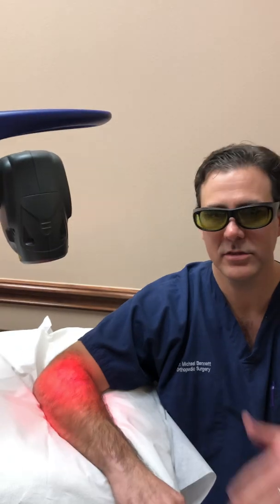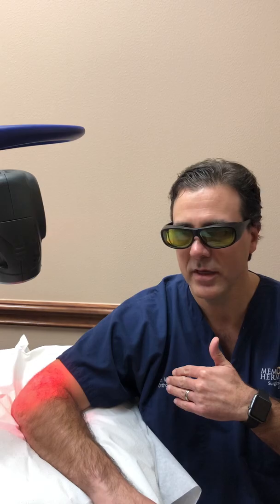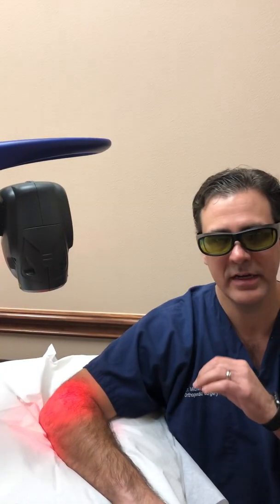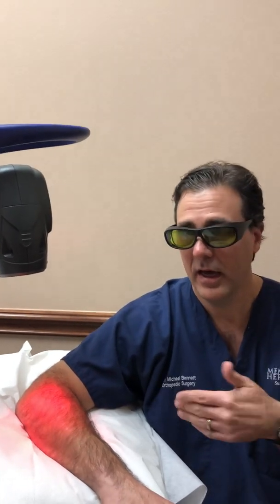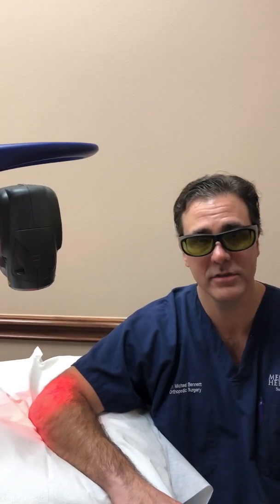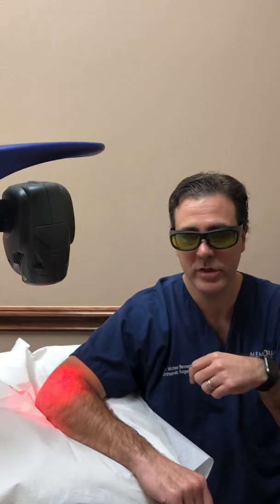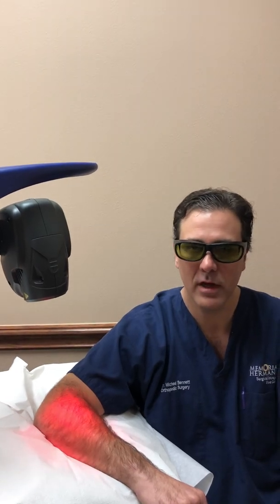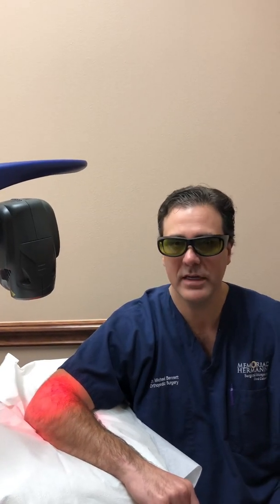Right now the laser already has a predetermined area that we program ahead of time using this robot, and it's administering laser pulses across the affected area. I have no pain — it doesn't hurt while it's being administered. I mean, my tennis elbow obviously does hurt, that's why I'm getting it done. But right now the treatment is not administering anything invasive, just a little bit of warmth. And that's basically it — we're going to do this for about five minutes.